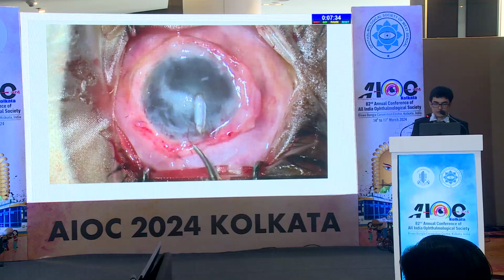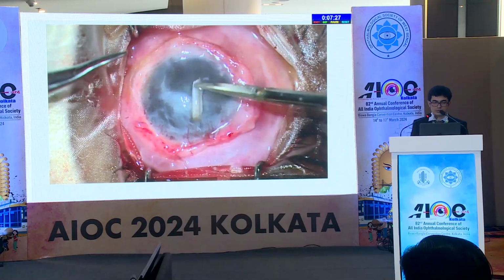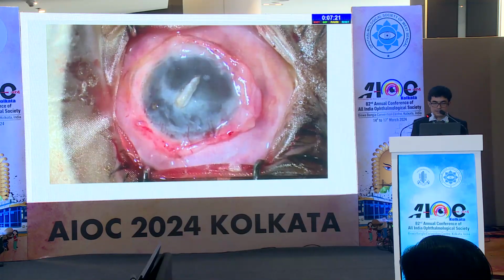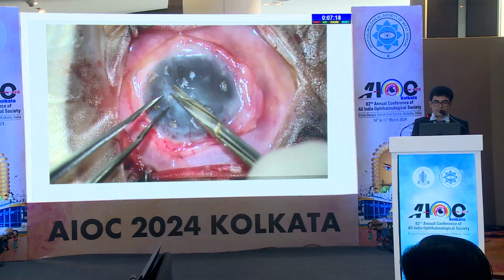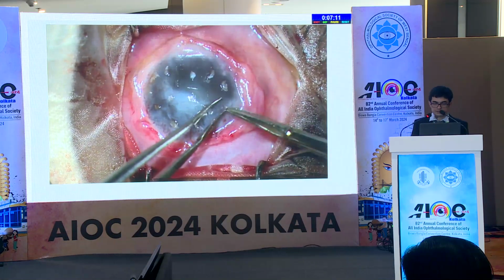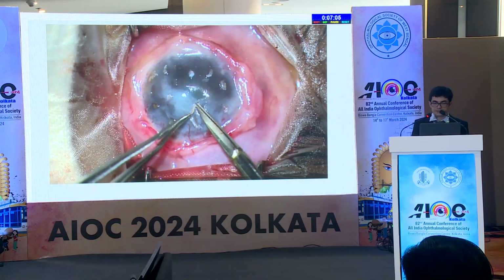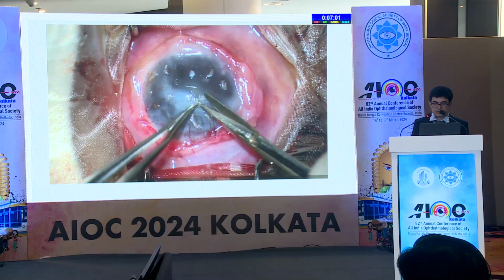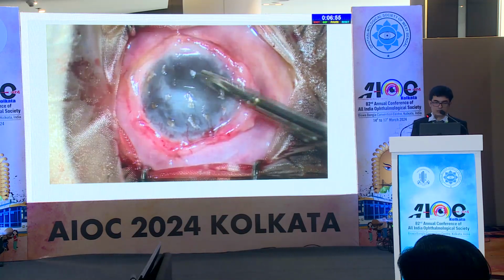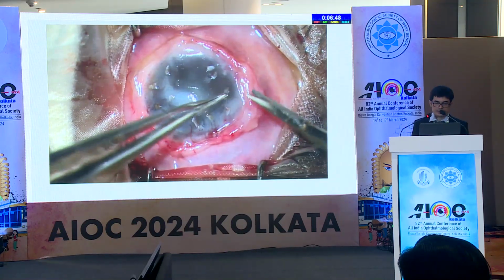Now the lenticule is put over it. It is cut into several pieces. The pieces should not be placed in the visual axis and should not be placed at the limbus either. They are placed slightly inside. If placed at the limbus, that may lead to long-term scarring or involve the visual axis. So they are placed all around. They are placed epithelial side up, which can be seen. The white side is the stromal side. So epithelial side up, we try to place, although the stem cells will find their niche even if placed the other way around, but we try to place them epithelial side up.